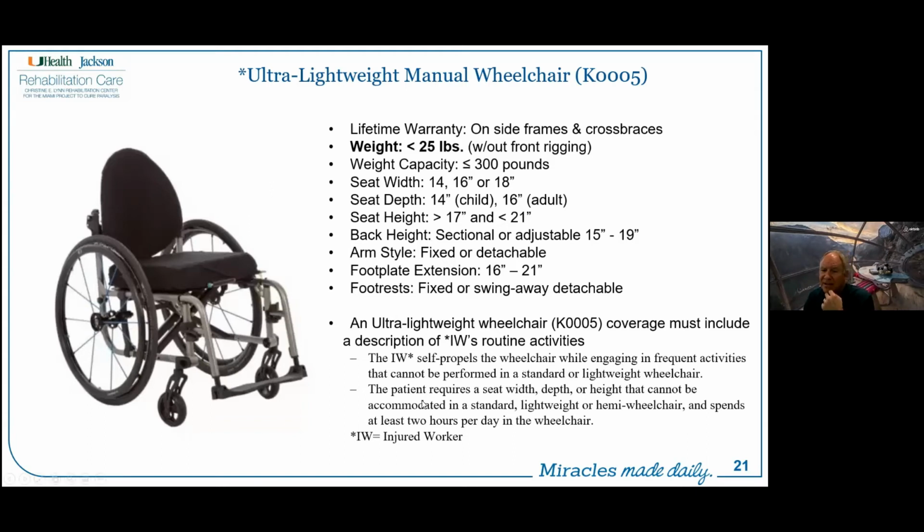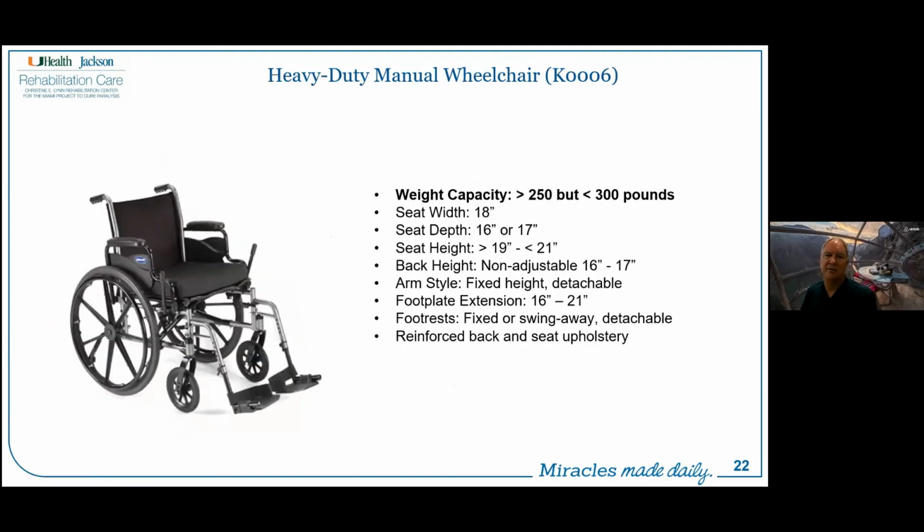The other thing is that the client requires a seat depth, width or height that can't be accommodated in a standard lightweight or hemi wheelchair. And the person spends at least 2 hours per day in the wheelchair. Now, again, this is written for injured workers, workers' compensation, but we use these same types of justification for persons with spinal cord injury.